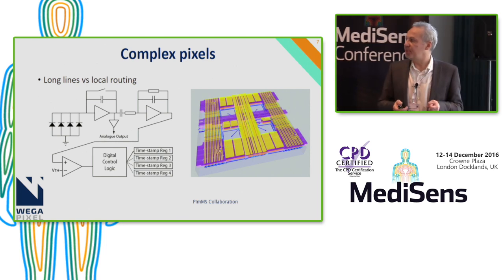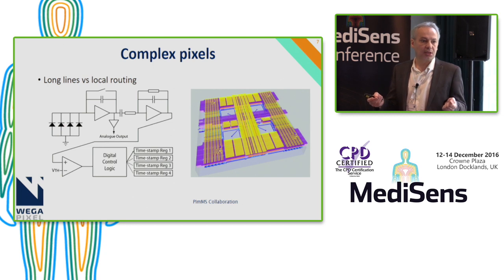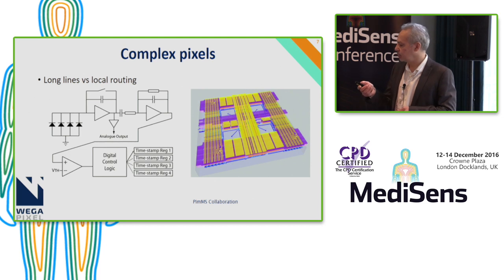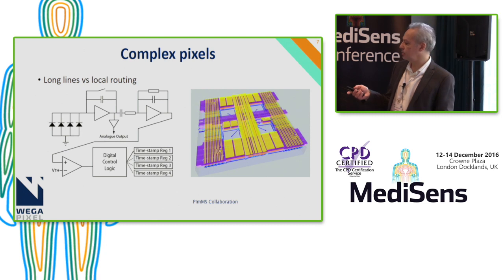And a complex pixel, of course, in CMOS is not complicated. Even you can do it in an active pixel sensor. There are other complications. Maybe I don't want to enter into this, but it is possible to do complicated electronics with high quantum efficiency in CMOS, and that's one of the designs I did in my past work at Rutherford Laboratory. So that's a pixel which is very much like a hybrid pixel for those of you who know. And it has about 600 transistors in 70 micron pitch.